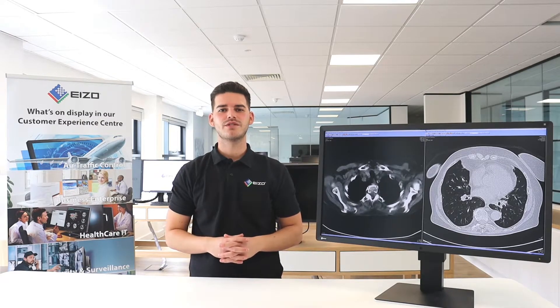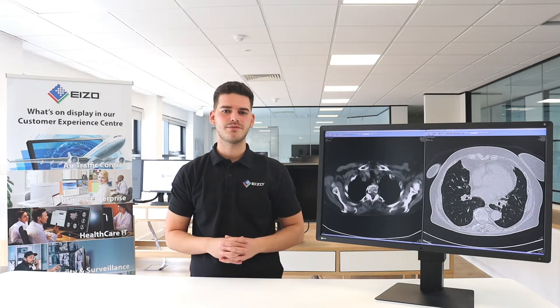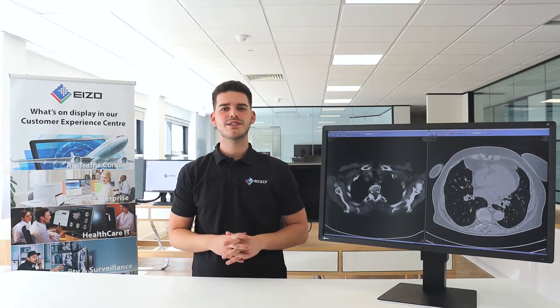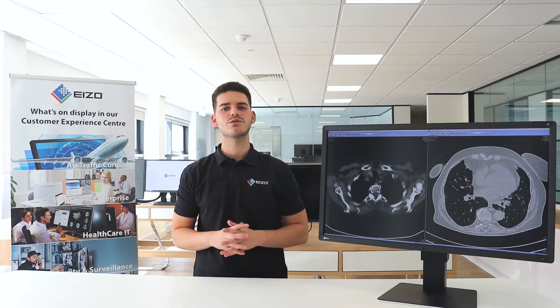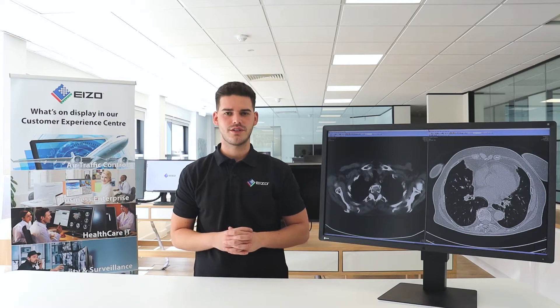By utilising the MX315's increased viewing space and freedom of layout, it is possible to display various inspection images side by side. The picture by picture function this monitor has allows two different signals to display windows side by side on the one screen. You can use this function to view different workstations side by side without any bezels to distract your line of sight.